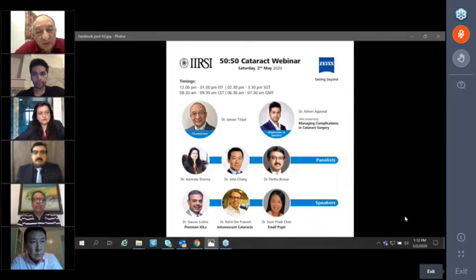I would advise people, especially in the case you showed, that with the reverse fluid current happening in the vitreous cavity, and then getting the entire bag out, there would be some turbulence in the posterior segment also. So towards the end of surgery, you need to assess the periphery and see if there's any point of dialysis or tear which has to be taken care of at that stage, or maybe subsequently within the next 24 hours. It's a must for all these difficult cases.